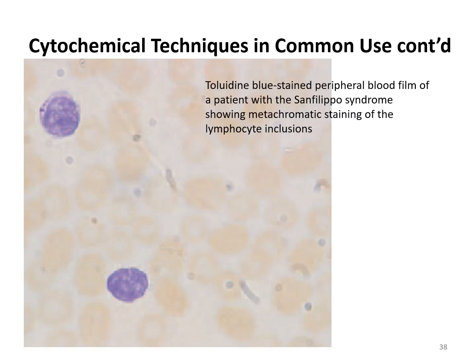So this is the result of staining using a toluidine blue stain. But in this case, what we can see are simply lymphocytes that demonstrate metachromatic staining, so different colors inside the lymphocytes. But of course, we expect this to be positive for basophils and for mast cells.